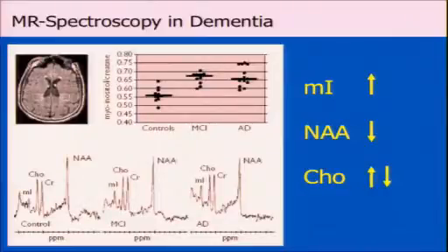Because spectroscopy, first of all, is not so easy in those kind of patients because they're not the most collaborative ones. And we know that MR spectroscopy is very sensitive on motion and others. And it's also very sensitive for iron deposition. So in the areas that are really interesting, the subcortical white matter and where we have already amyloid deposition and microhemorrhage, we do see a lot of artifacts.